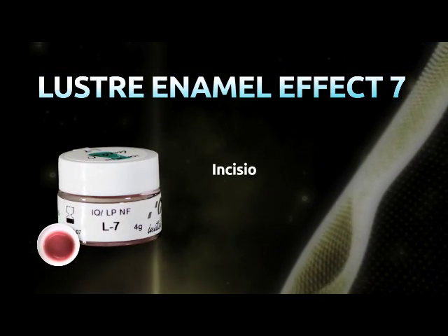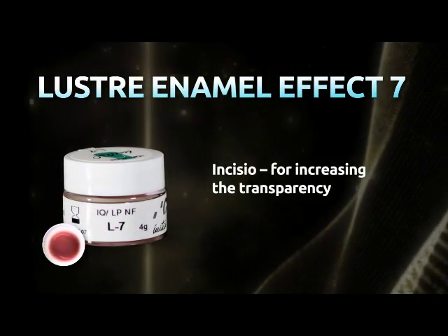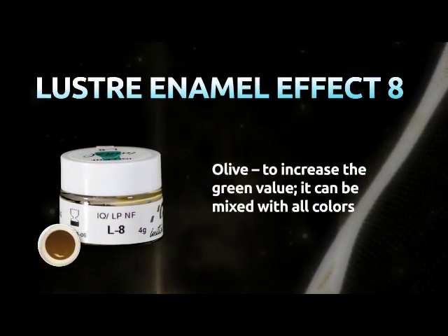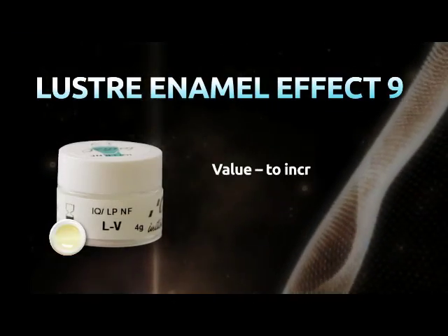Lustre Enamel Effect 7, Incisio: for increasing the transparency. Lustre Enamel Effect 8, Olive: to increase the green value — it can be mixed with all colors. Lustre Enamel Effect 9, Value: to increase the brightness.